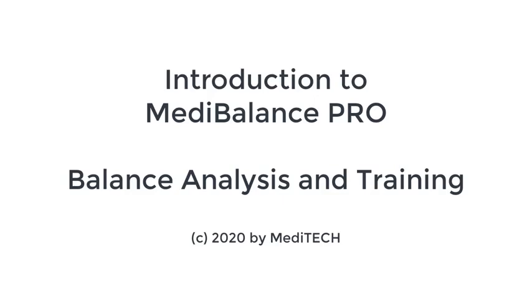This is a training session on the MediBalance Pro system. We are getting right into the topic. We start the pre-installed software by clicking on the corresponding icon for MediBalance Pro, which is the two figures in red and blue. The software automatically launches.